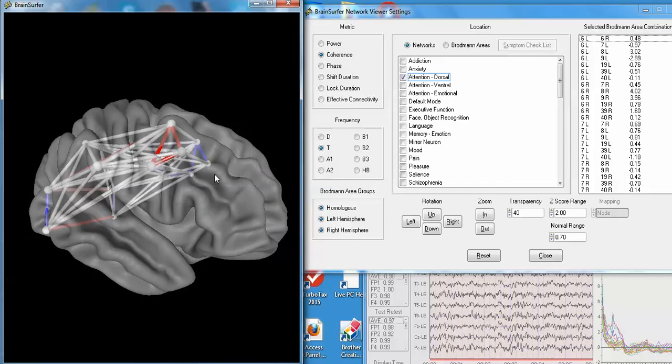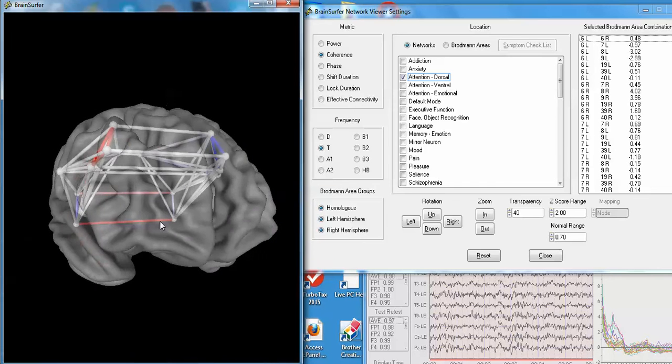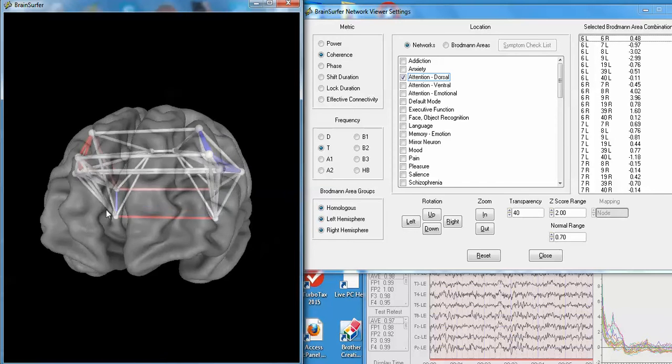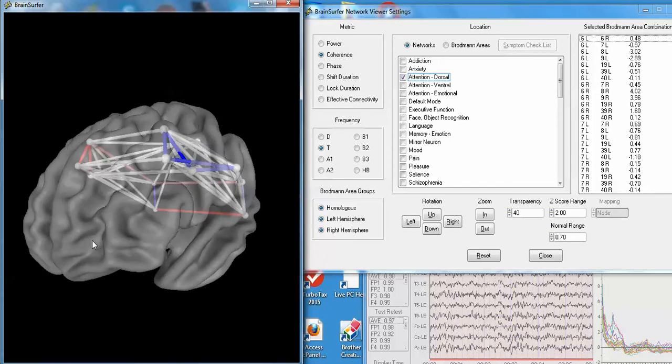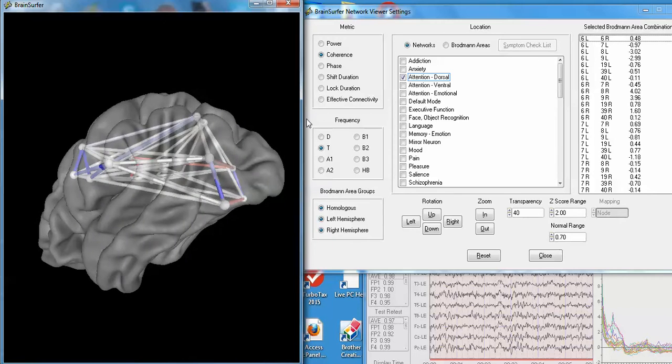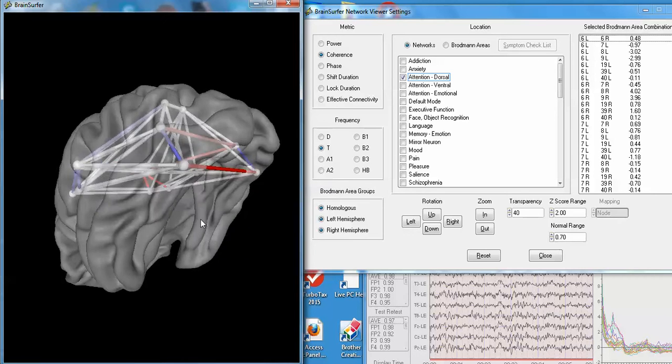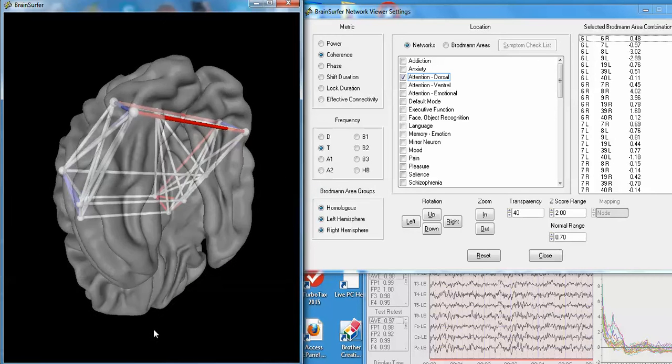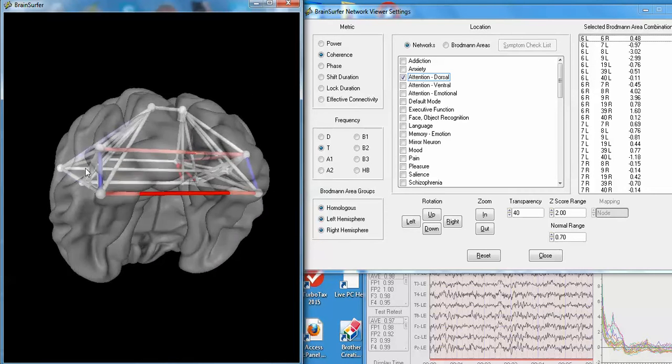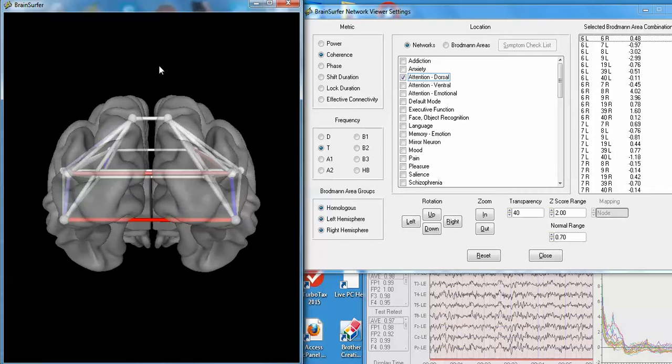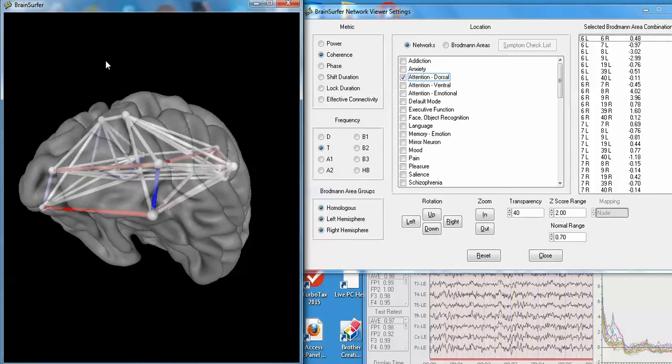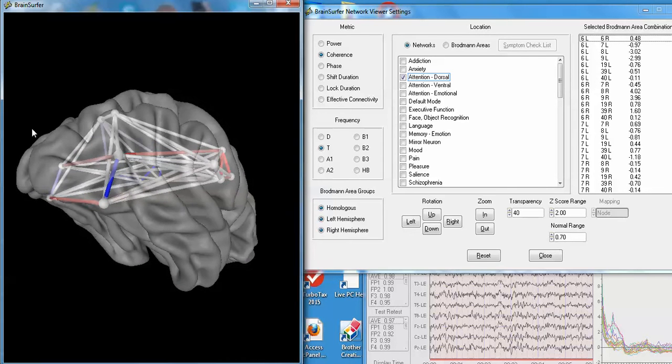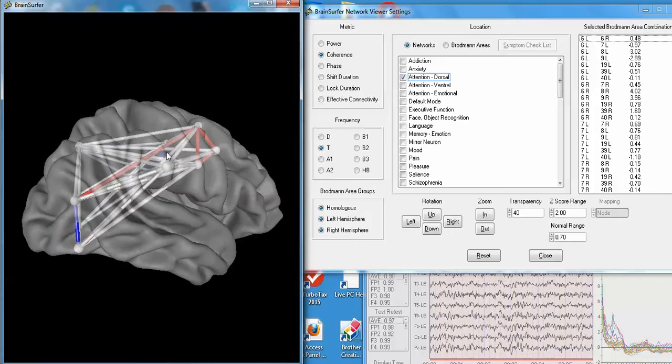I can resize it, rotate, look at the dorsal attention network, zoom in on the dorsal attention network, look at it from underneath, and evaluate the different aspects of the attention network as it relates to the patient's symptoms.